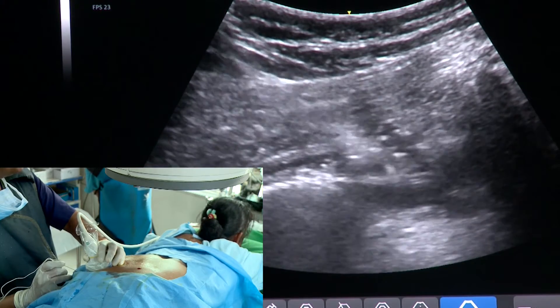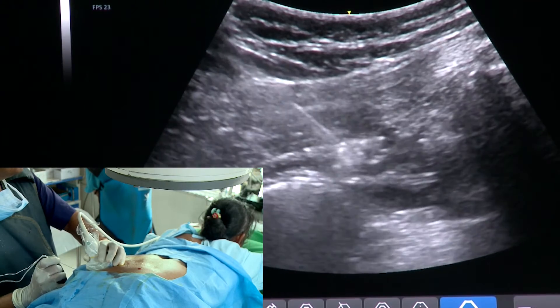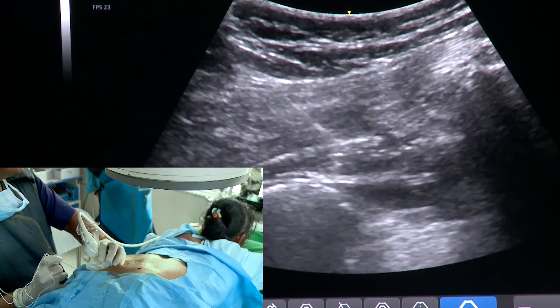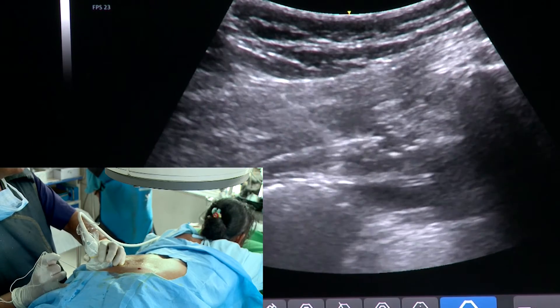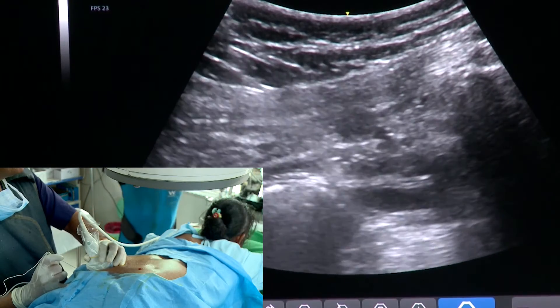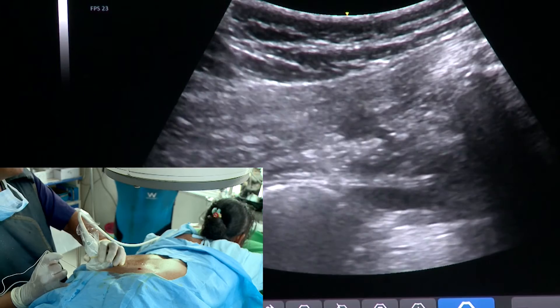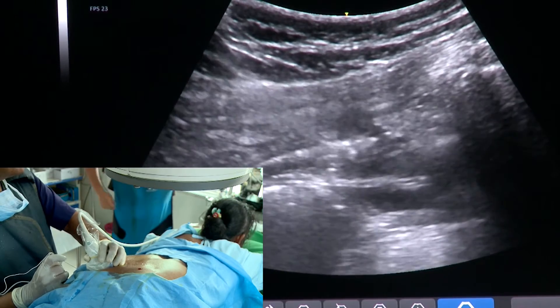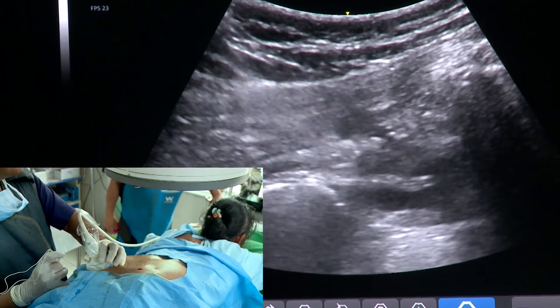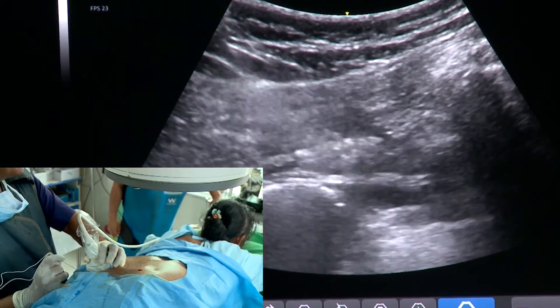This is the piriformis — I will be puncturing it a little bit on this part as well. Just puncturing also has an important therapeutic effect. You can see the two borders of the piriformis are very nicely seen: this is the upper border and this is the lower border. So this is basically a trigger point injection and hydrodissection of the sciatic nerve.